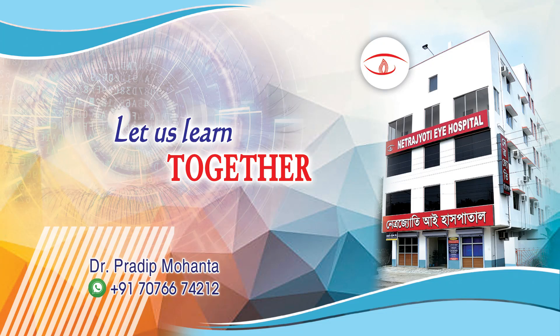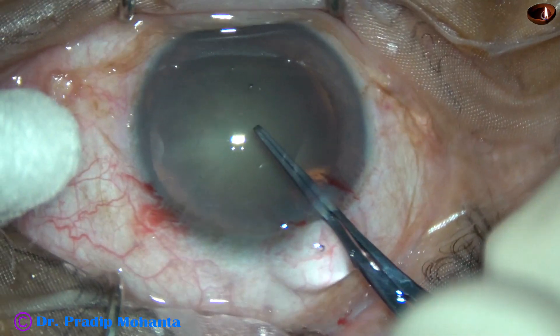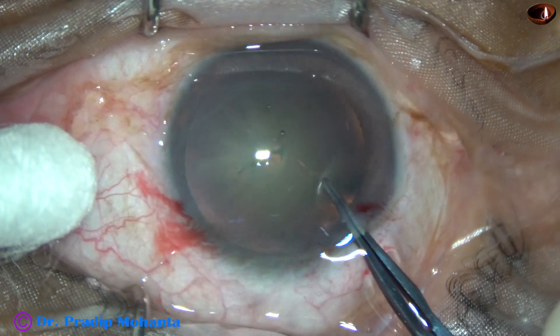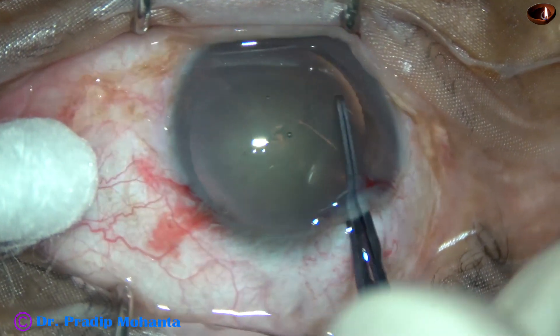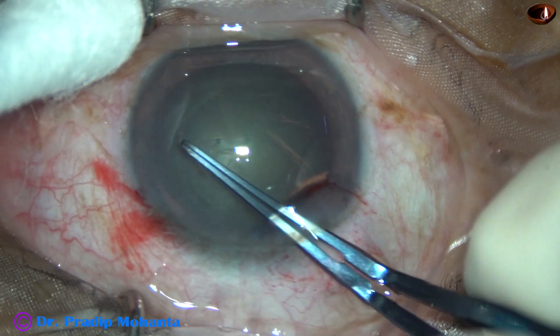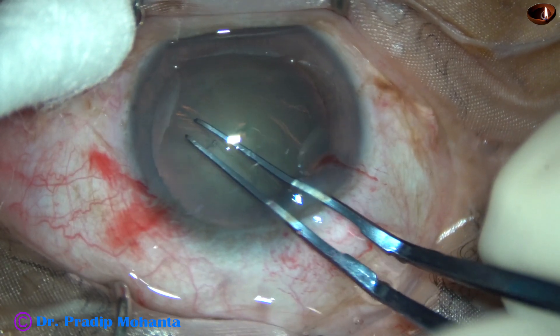In this video we are going to see two ways of dividing a nucleus. First, direct chop of the nucleus. This is a cataract with grade 2 nuclear sclerosis. We can either go for direct chop or pre-chop in such cases.